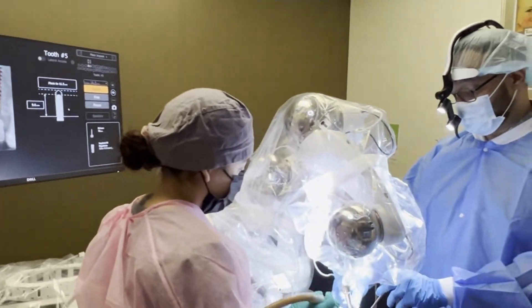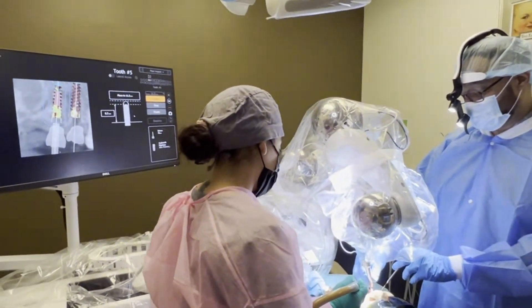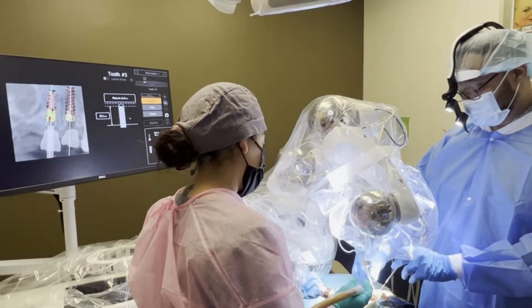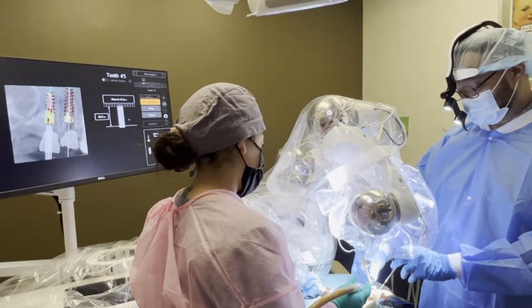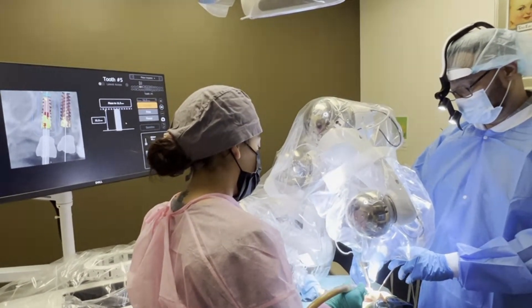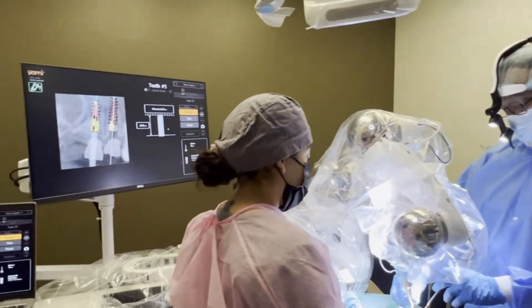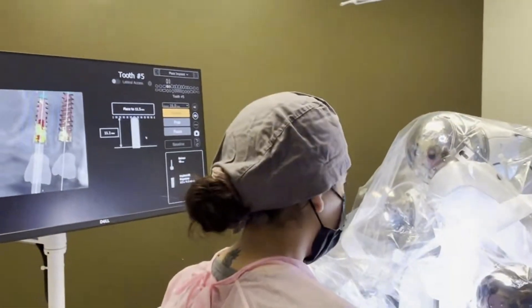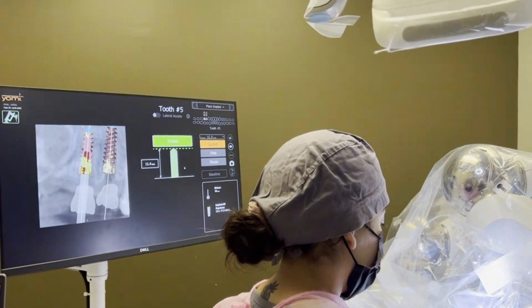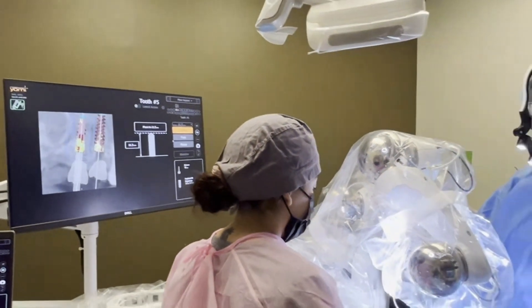This sound is telling me that it's locating at the torque now, but it has not reached the final. 10mm. 1mm, 1.5, 1.5, 1.5, 3, 3.